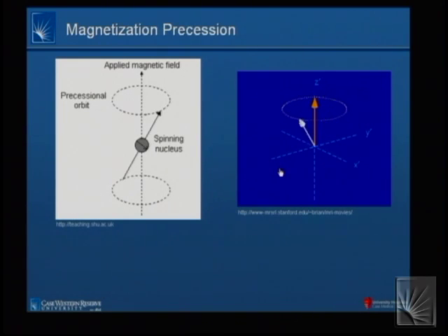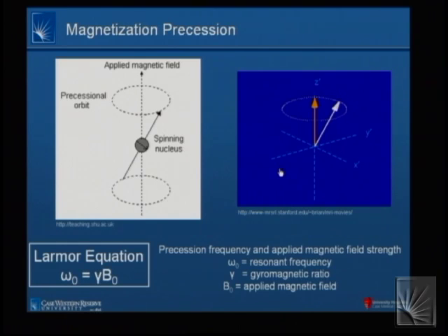So this creates a little bit of a challenge for me, in that while I have this magnetization that will precess about any field that it sees, the challenge is it's a needle in a haystack problem. When I look at the aggregate of all the protons for Dr. Leparo, that net aggregate, that bulk magnetization, is going to be pointed along the same direction as the main magnetic field. The total amount of magnetization is very small. It's pointed along something that's really big, and therefore, in its original orientation, I'm not going to be able to detect it. Somehow I needed to get it to change its orientation.